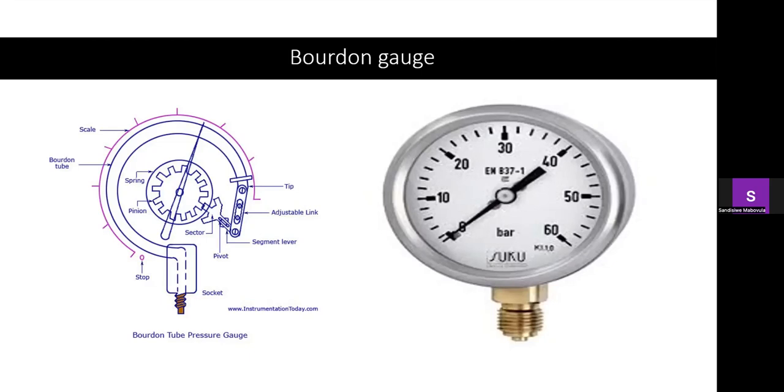It's only after you have almost completely run out of the liquid form that you will see the pressure going down. Unlike oxygen, when you use up half of it, you can see that half reflected on your gauge. So you need to weigh the nitrous oxide in order to know how much you have.